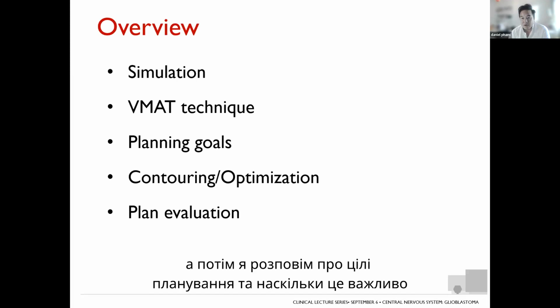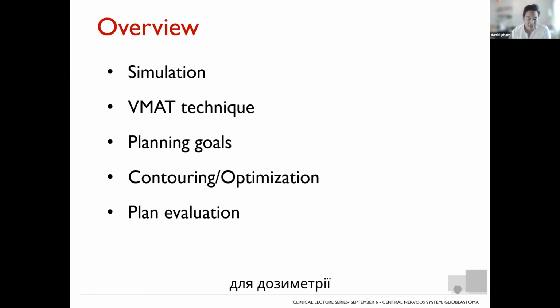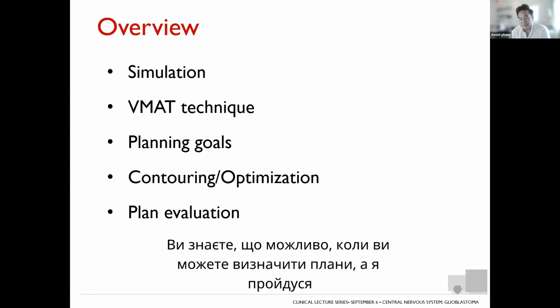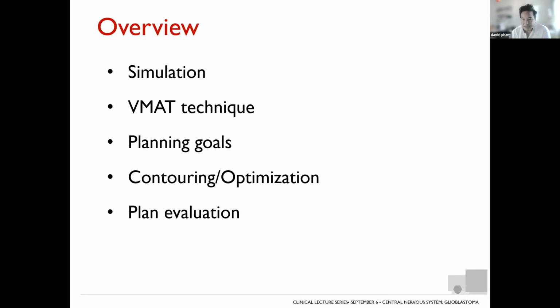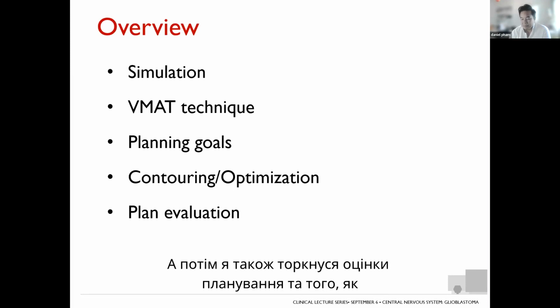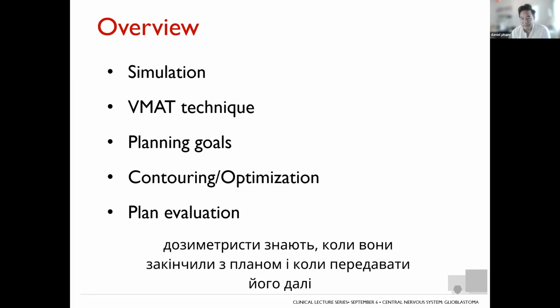Then I'll talk about the planning goals and how that is important for dosimetry to know what is possible when determining the plans. I'll go through a bit about the contouring and optimization process as well. And then I'll also touch upon plan evaluation and how dosimetrists know when they're finished with the plan and when to hand it off for review.